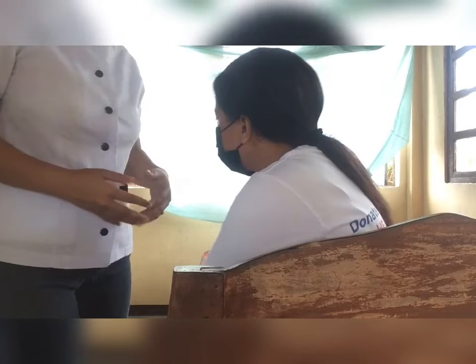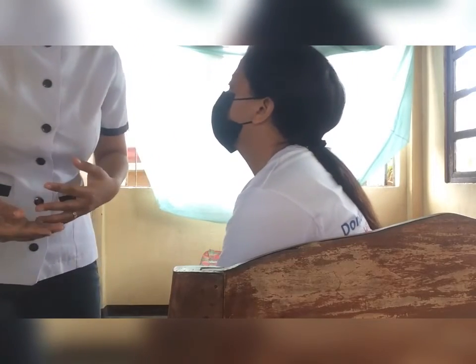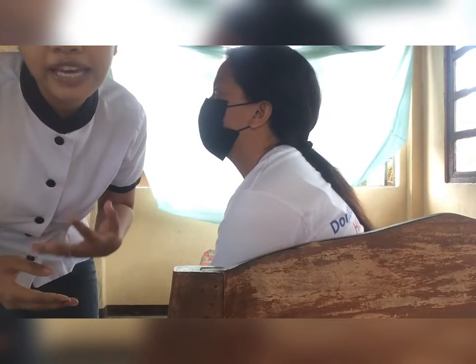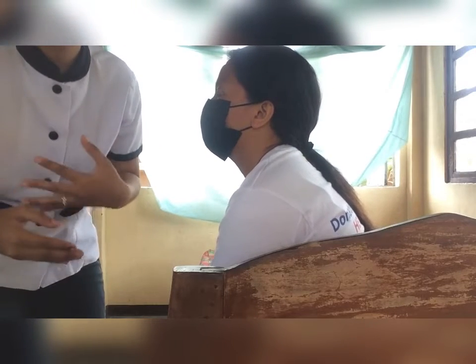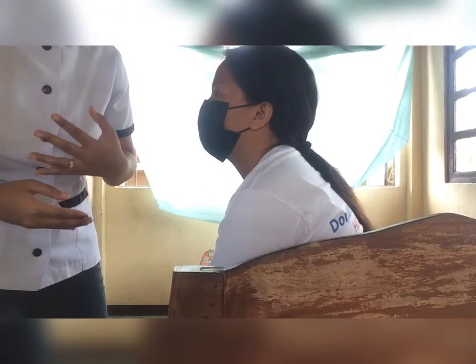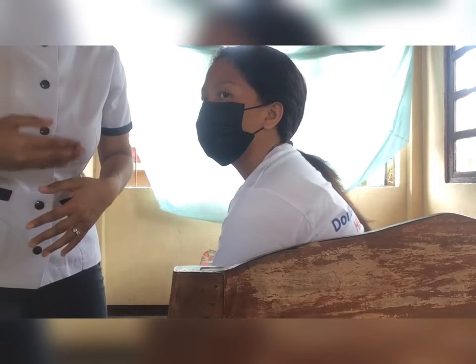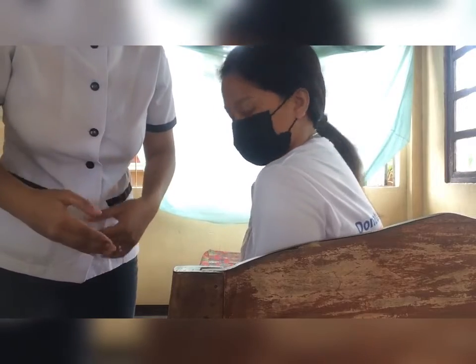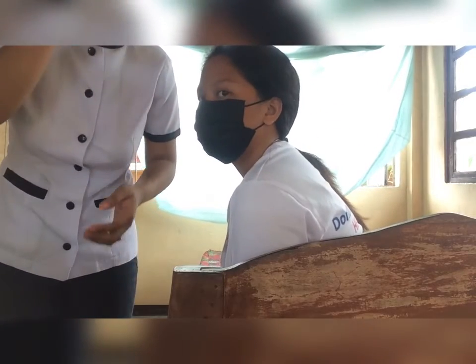By performing the Weber test, set the fork into light vibration by tapping it in your hand, and then place the vibrating tuning fork firmly at the top of the patient's head or at the mid forehead, and ask the patient if there is any hearing loss she feels.